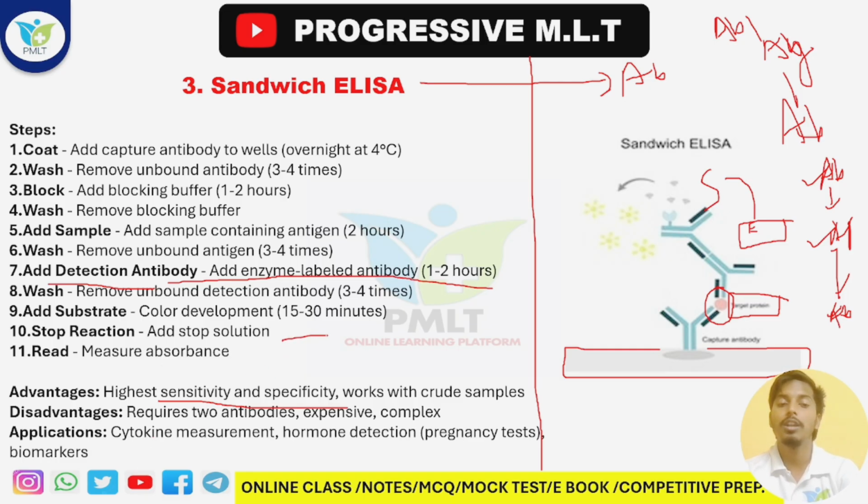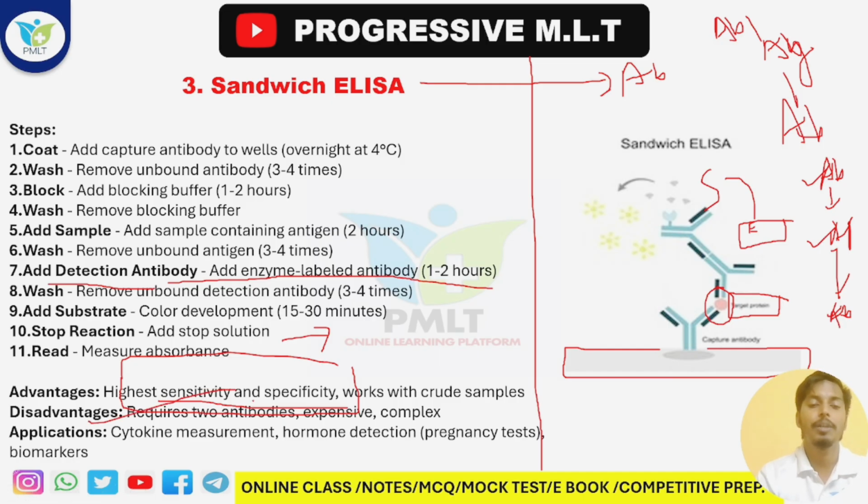In every ELISA, stop solution is required, because stop solution helps stop the color development. Without the stop solution, the color will keep developing and you will not find the proper result. Okay, I have already told you that it is highly sensitive and highly specific. Hope you have understood. The steps are almost the same in every type of ELISA. Okay, here we use the sandwich ELISA for cytokine measurement, hormone detection, pregnancy test, and biomarker test. Now it is very widely used.